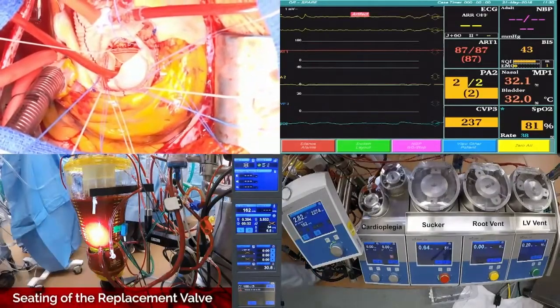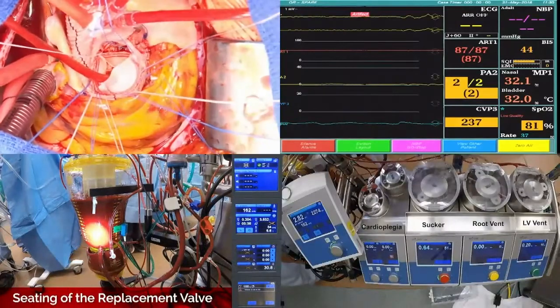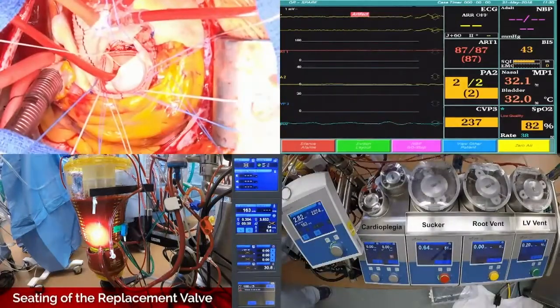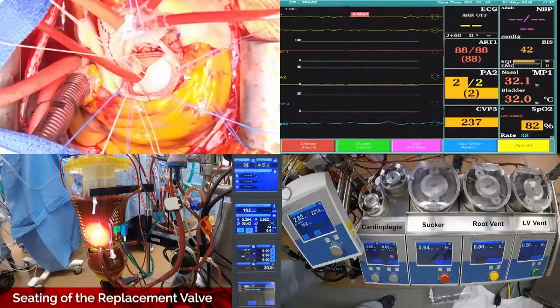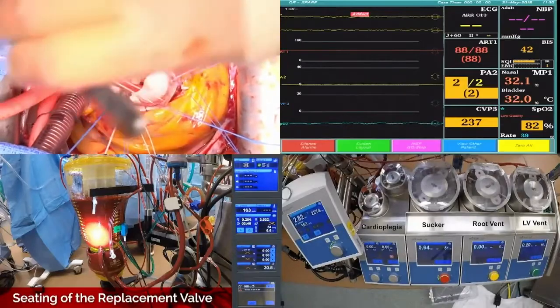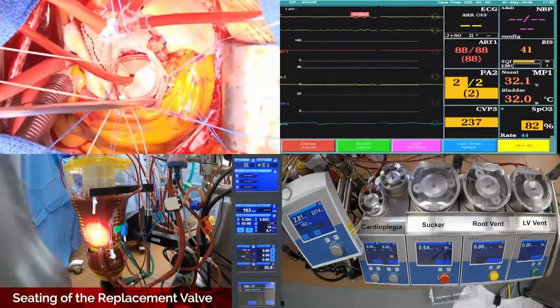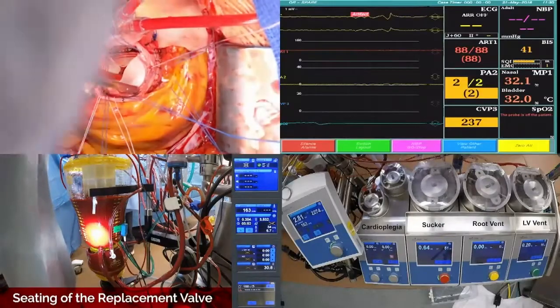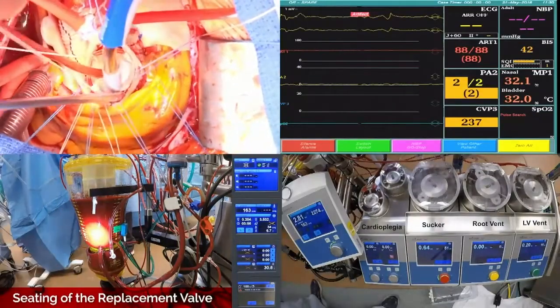I like to make sure I definitely see the coronary ostia, and make sure it gets on the right edge, the correct edge of the annulus. Man, that's a pretty view. Then it's a little loose, and then you get your paravalvular leak. So there's kind of like two ridges there. I mean, look at there, it goes down, and that's it.